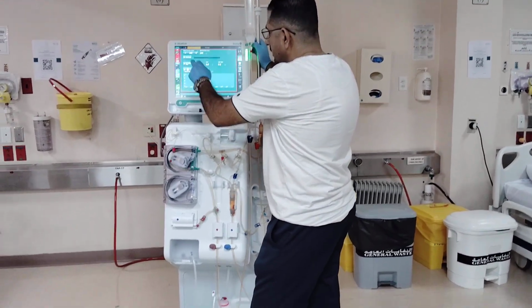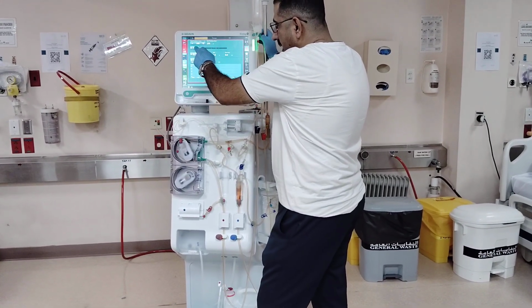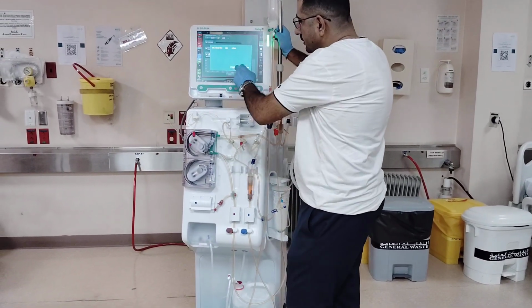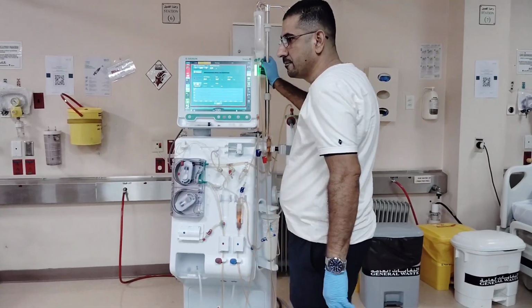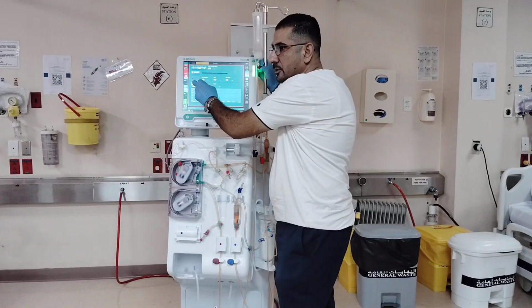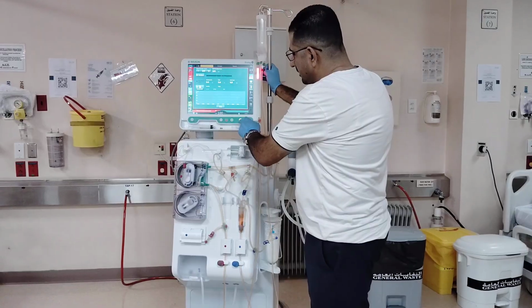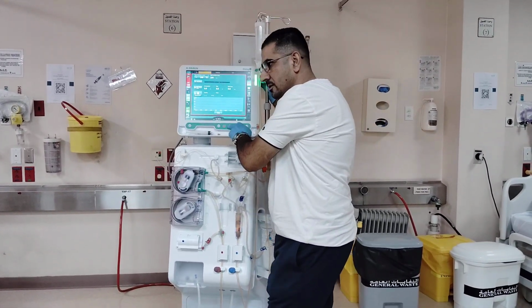Also, you can press minimum blood flow, and by pressing the minimum blood flow, this one, it will decrease automatically to 50 to 100 blood flow. And also you can measure the blood pressure by pressing here. Yes, pressure or limit before you decrease the blood flow, or increase the blood flow.